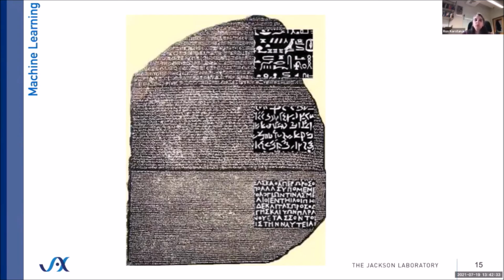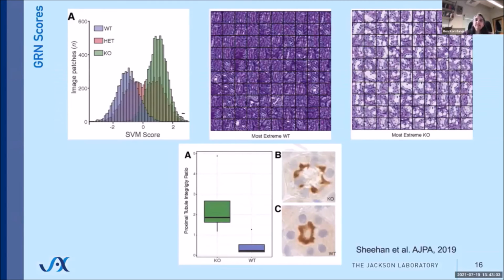We also know what the vocabulary is for the computer to see images, and that is a series of numbers and mathematical operations. What we don't have is the bridge that says that if a computer sees this pattern in the mathematical data that represents the image, it correlates to this vocabulary term that the pathologists use, and that's what we're building.